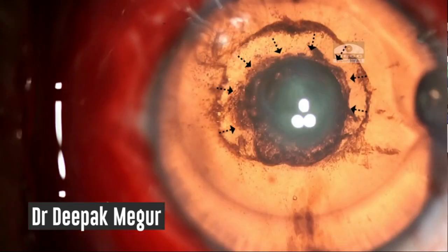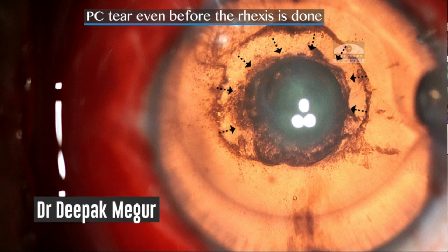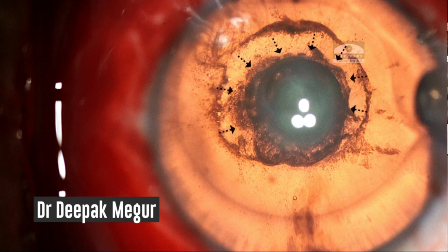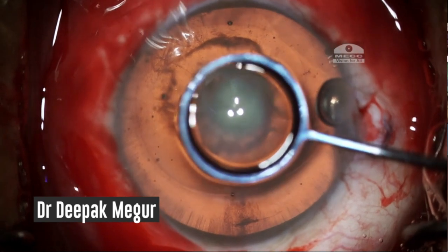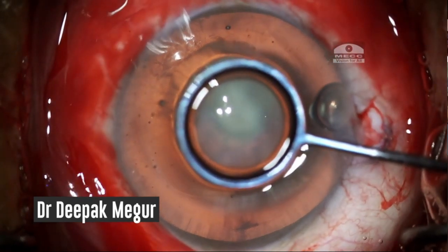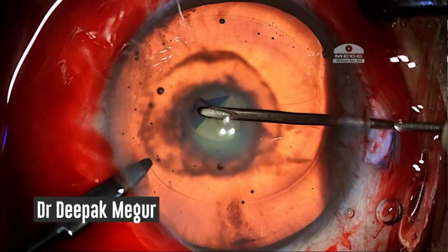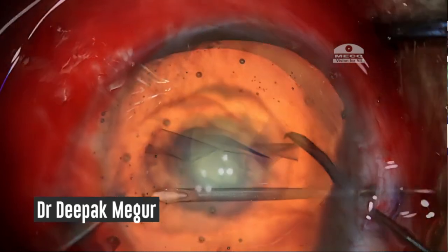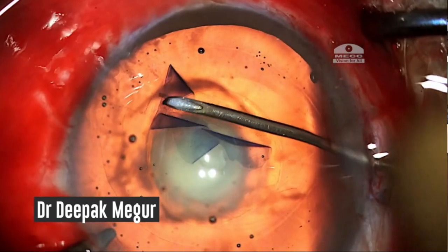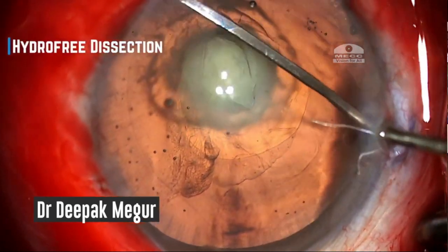This was something very unusual and clearly suggestive of a potentially open posterior capsule now. So my plan was to assume that the posterior capsule was ruptured, although it was not very clearly evident, and all my subsequent strategies had to be taken with this consideration. So the rhexis sizing and centration was the most important thing, because I would want to have an optic capture, because the PC was probably defective in this case. So I'm aiming at a well-centered 4.5 to 5 millimeter rhexis, which could be achieved quite easily.